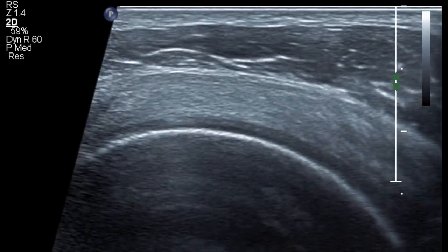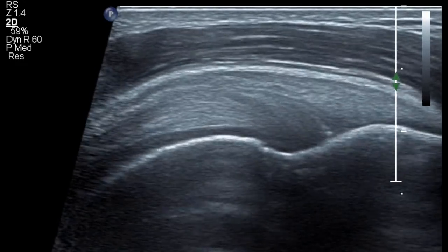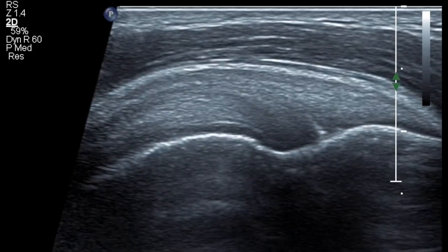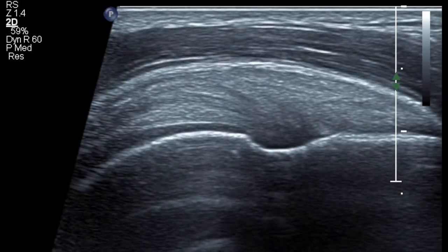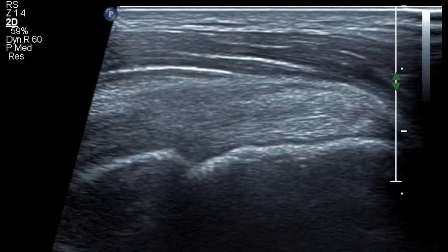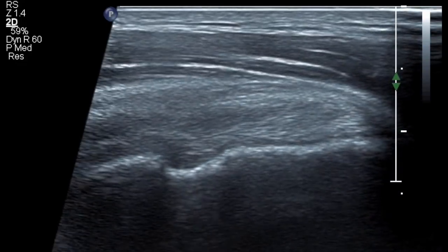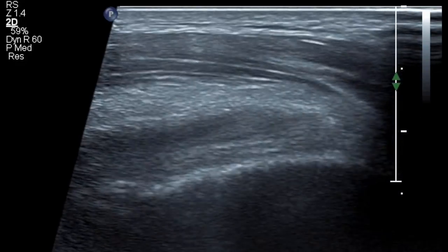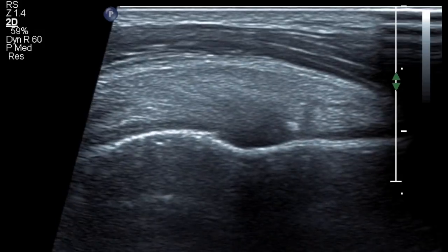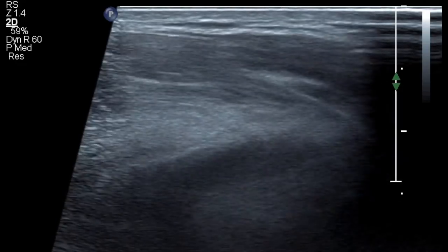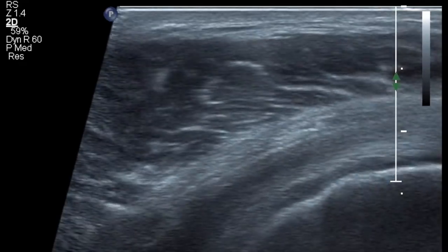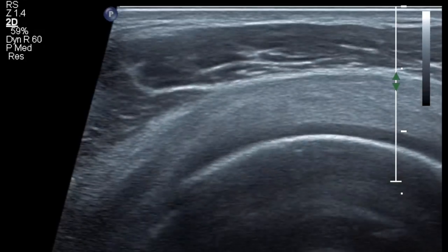Anteriorly it appears more protuberant, and as you move out posteriorly it becomes flatter and flatter. So the anterior fibers are of supraspinatus. The posterior fibers constitute the infraspinatus. So when the greater tuberosity becomes more flat, you are probably at the level of the infraspinatus.